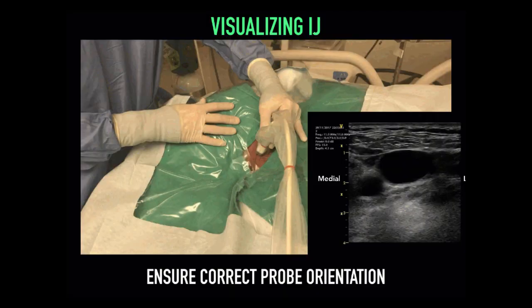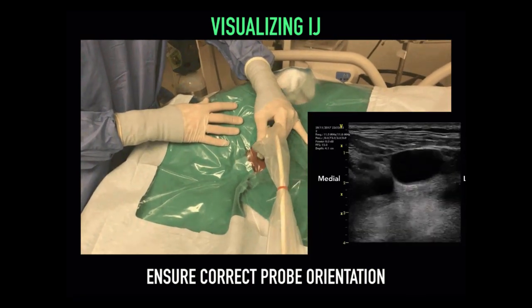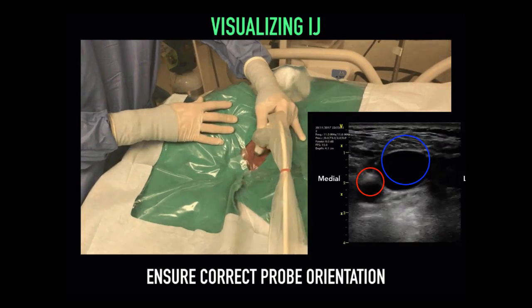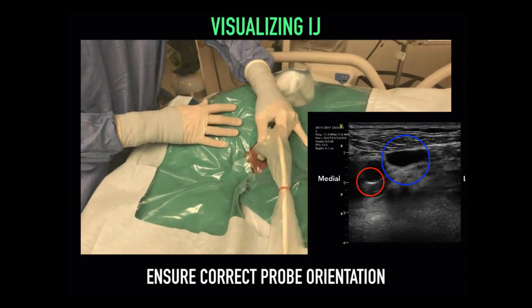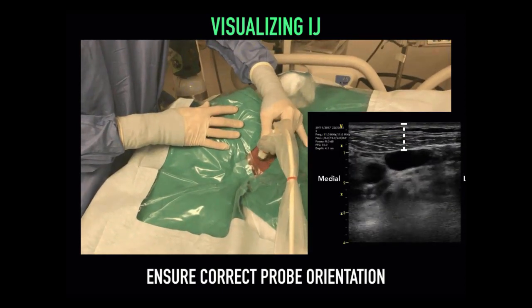In this case, we can see in real time how we're visualizing the IJ. We can see on screen left the carotid with the corresponding IJ on the right, again oriented medial and lateral on the right side of the neck. We can also use ultrasound to help understand the depth of the vein.